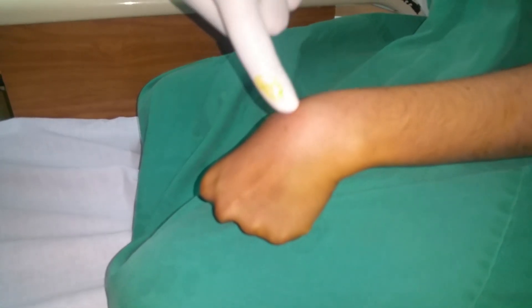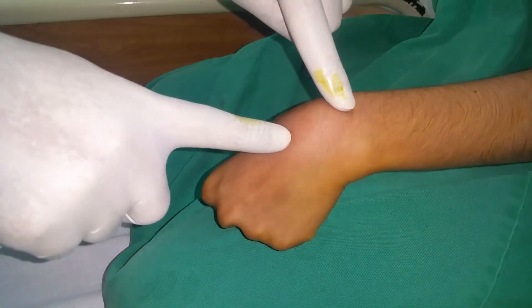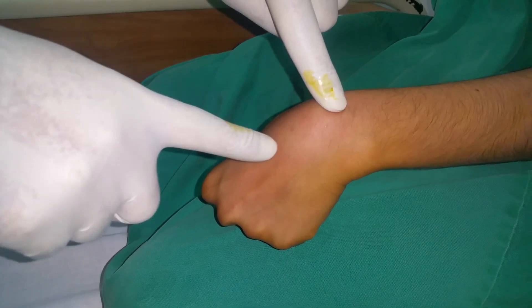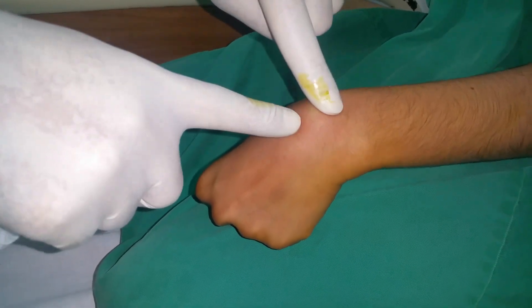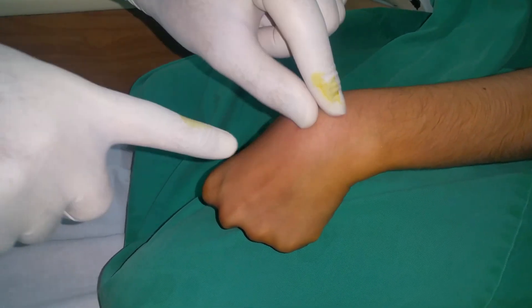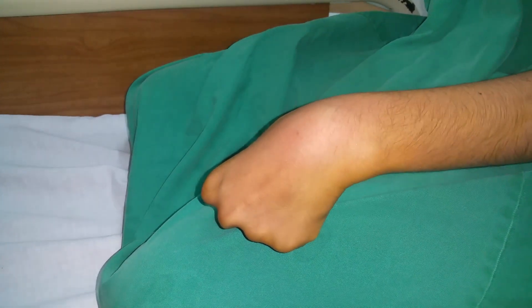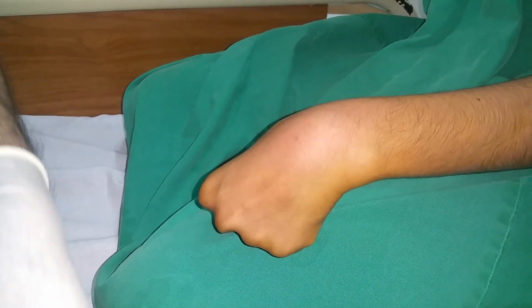This is a dorsal radial ganglion. We have initially injected xylocaine to anesthetize this area. It is a symptomatic and painful ganglion and we are going to aspirate it with a wide-bore cannula.